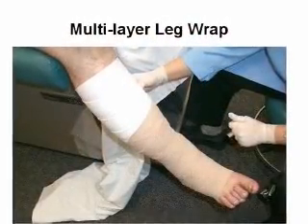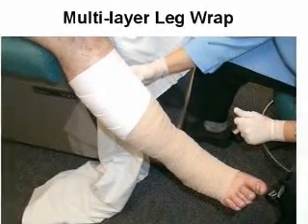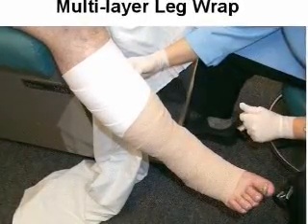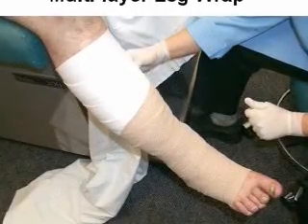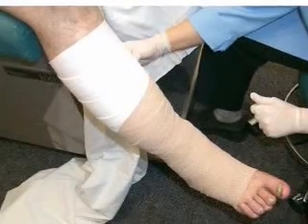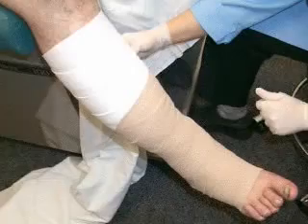Wrapping the swollen leg prior to measuring for a stocking is essential in order to establish a good fit for the stocking. If one fits the swollen leg with a stocking alone, it will fall down within a day or two, and the patient and the doctor both will be unhappy. Careful wrapping of the leg prior to putting on the stocking is essential in the treatment of these legs.